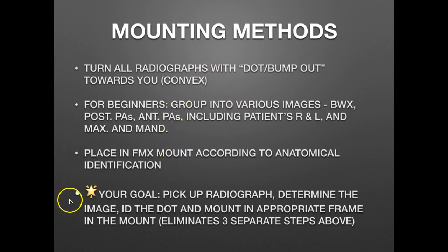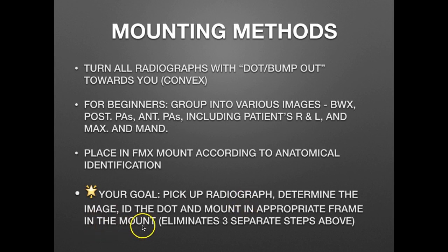These are the steps for a beginner. Keep in mind that once you learn this skill and are working with film, you should be able to mount an FMX in less than five minutes — your goal is actually two minutes. Rather than working through all these step-by-step procedures, your goal is to pick up one radiograph at a time from the pile, determine what the image is, make sure you have the bump or ID dot towards you, and place it in the appropriate frame. This is your goal in learning how to mount quickly and accurately.